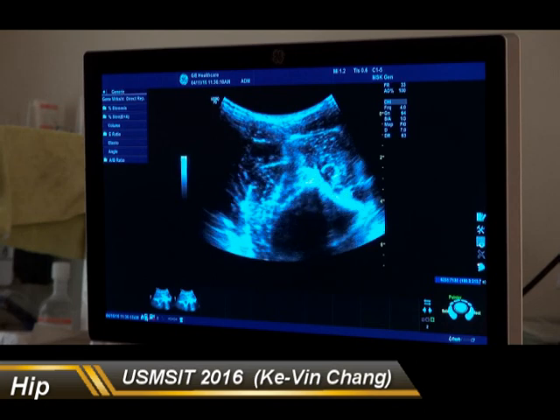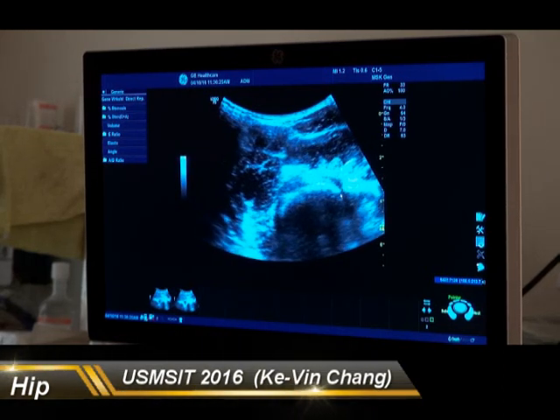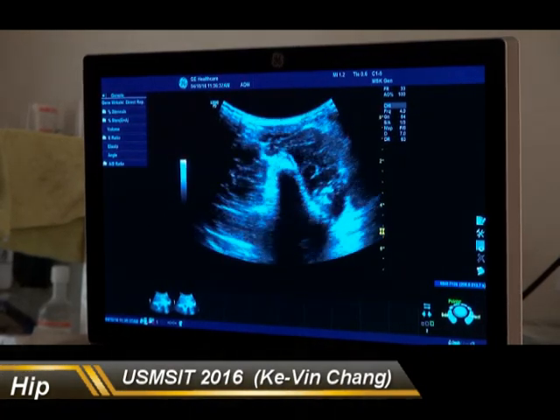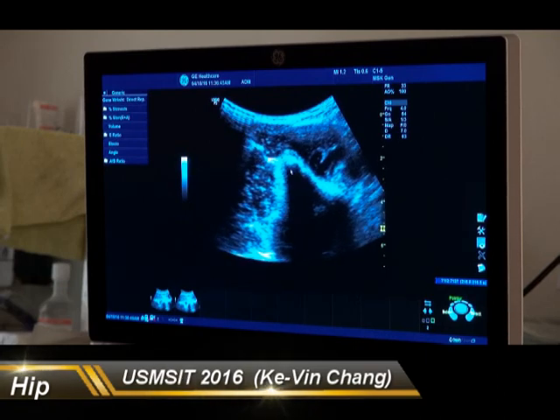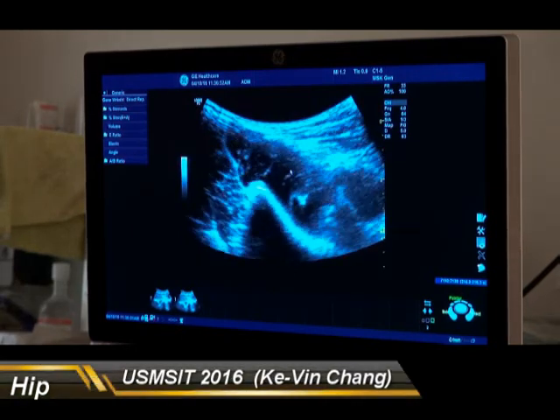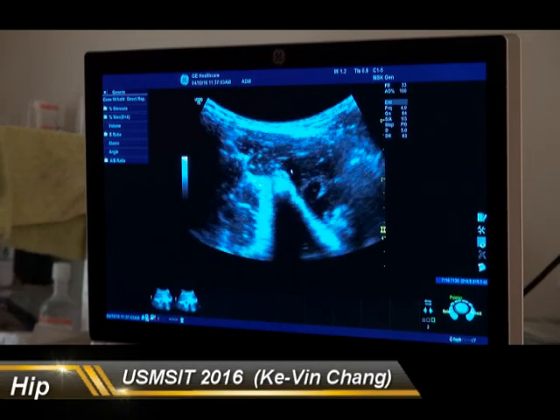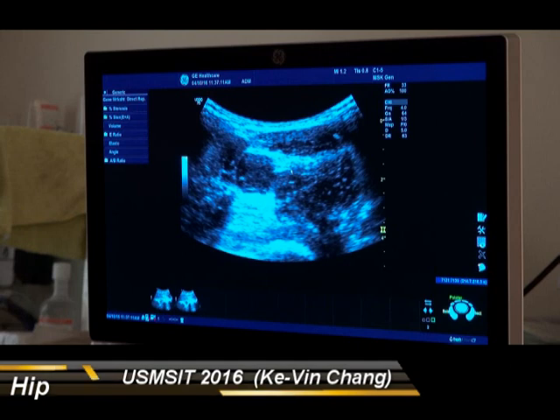The iliopsoas passes the hip joint over here. Sometimes we have patients with anterior snapping hip. In anterior snapping hip, the iliopsoas muscle will rub against several structures — the most common one is the anterior inferior iliac spine. In this view, we can ask the patient to flex and extend the hip to see the gliding of the iliopsoas against the anterior inferior iliac spine. The structure connected to the anterior inferior iliac spine is the rectus femoris.